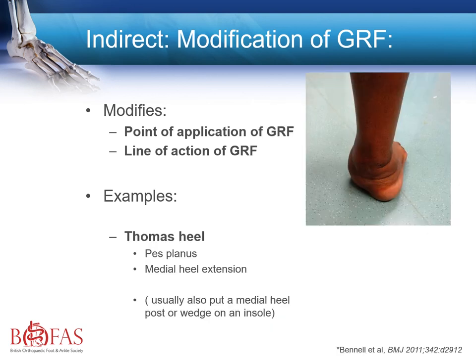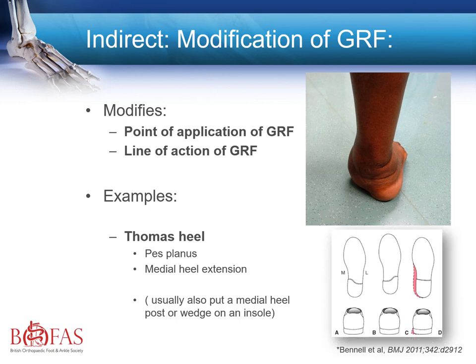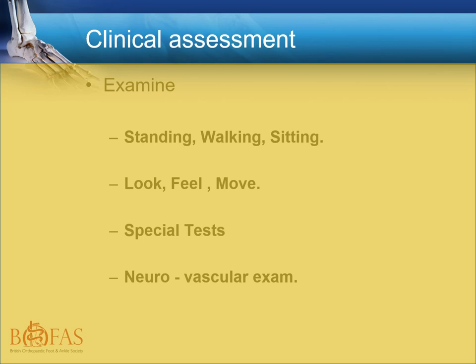Here, the extended surface area medially moves the ground reaction force medially and prevents the overloading on the outside of the hind foot. When deciding which orthotic to use, the same principles as stressed throughout the course are considered.